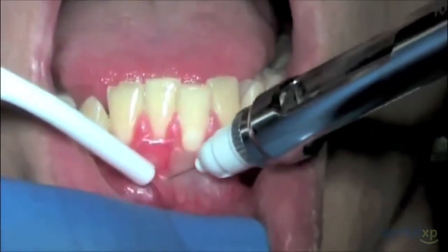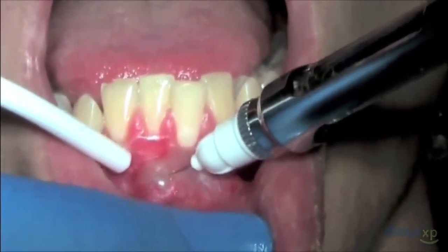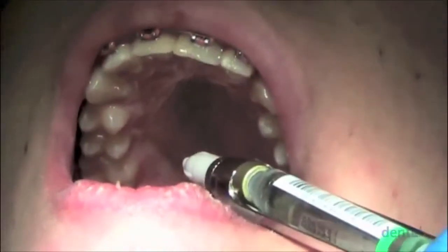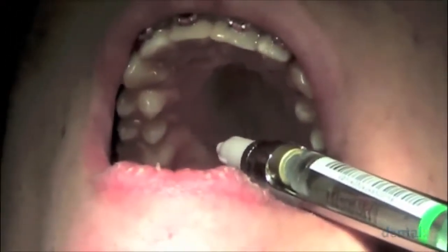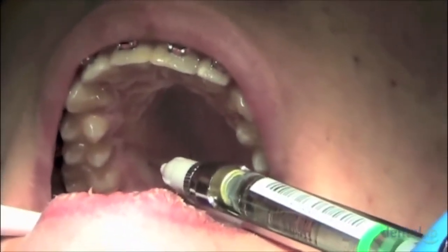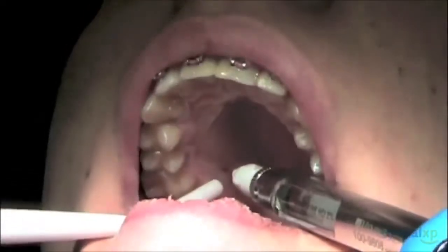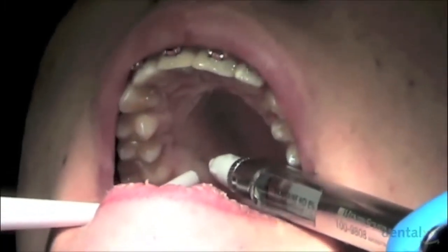As we're infiltrating around the facial surfaces of the incisors, you can see how the mucogingival line goes straight through the gingival margin of tooth number 24. You can also note the location of the high midline frenum attachment as well. For the palatal injections, we're using 2% lidocaine with 1 to 50,000 epinephrine to aid in vasoconstriction.